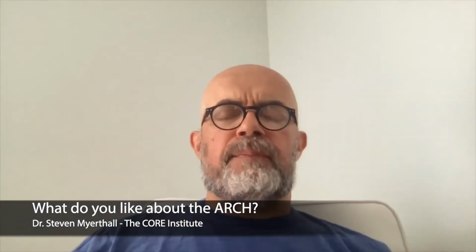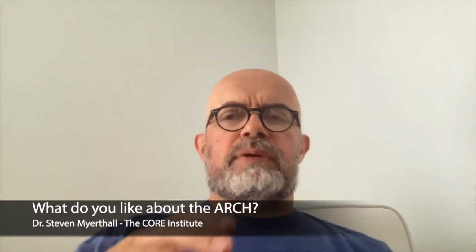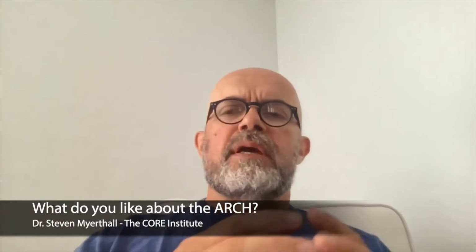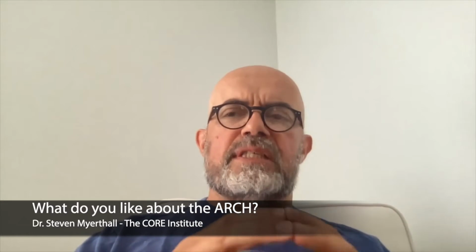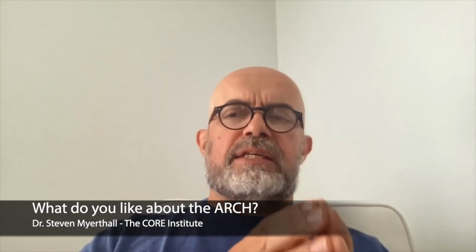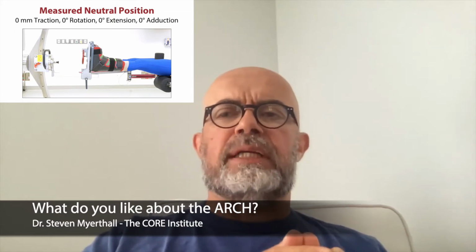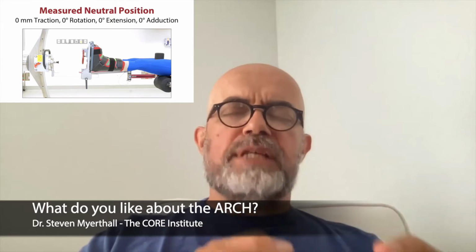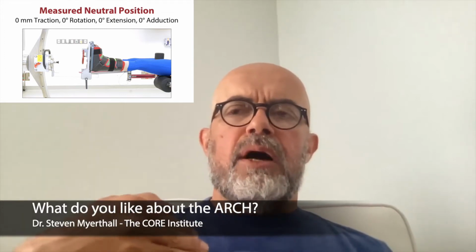Personally, I use robotic assisted surgery. So there's a method of measuring your preoperative offset and leg length and your postoperative. Because the way the arch table is designed, you can lock it into 0 degrees of rotation, 0 degrees of flexion or extension, and you can actually objectively measure the level of traction that you have on the limb.